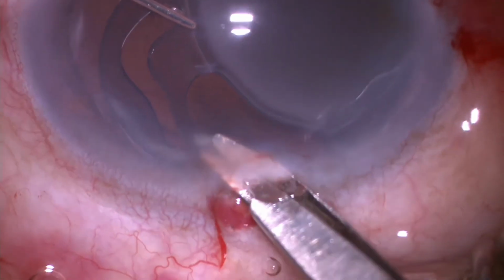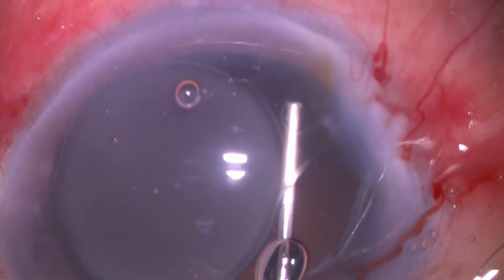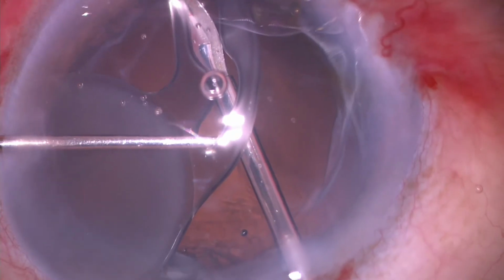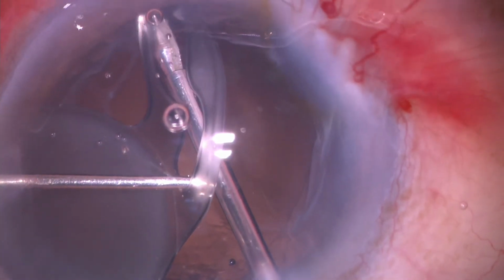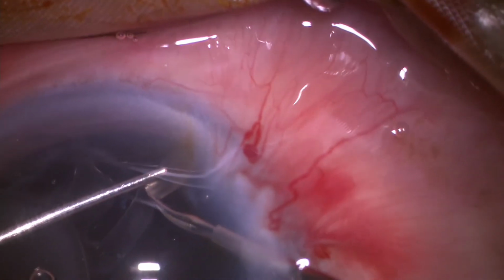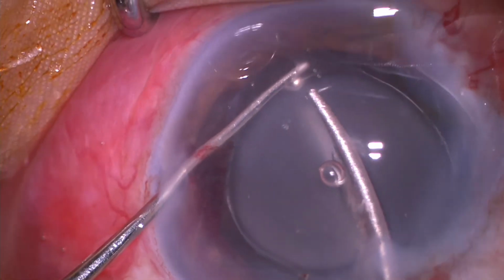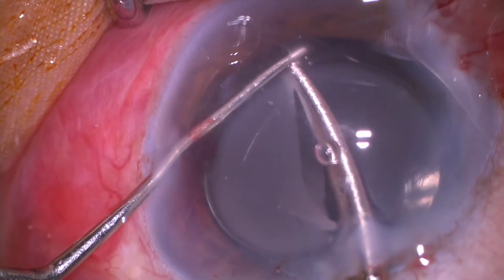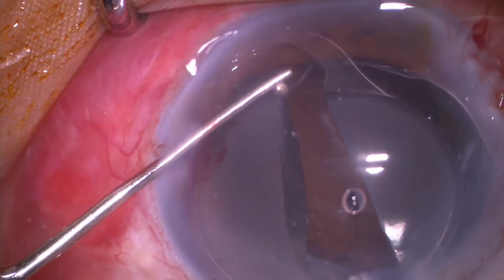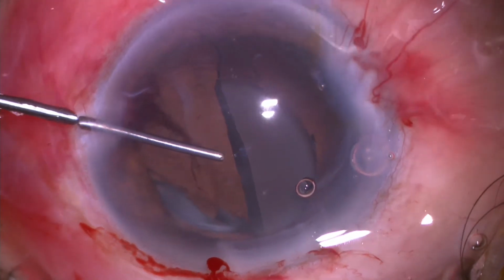In order to retain a capsular support, haptics were cut, leaving behind the fibrosed ends. Inferior haptic was accessed through the side port and was cut with micro scissors. Optic of the IOL was cut. The two halves of the optic were explanted from the micro incision.